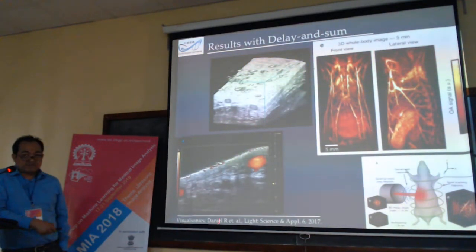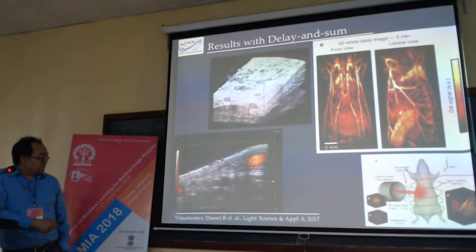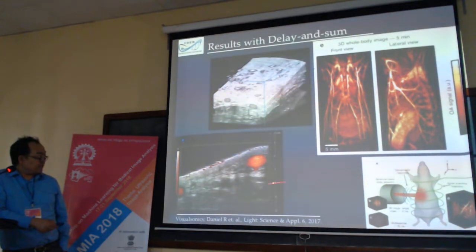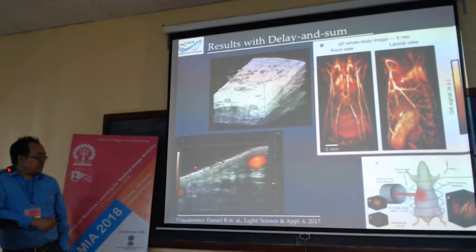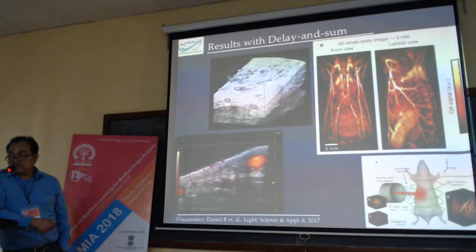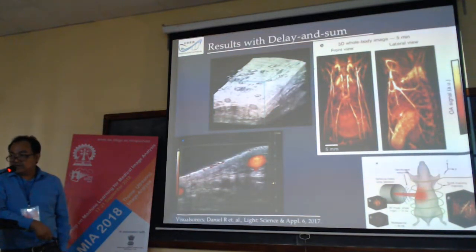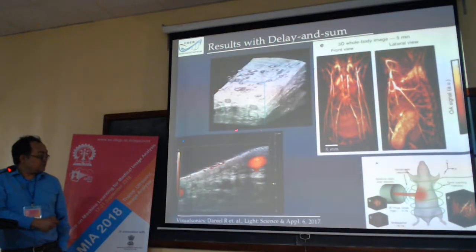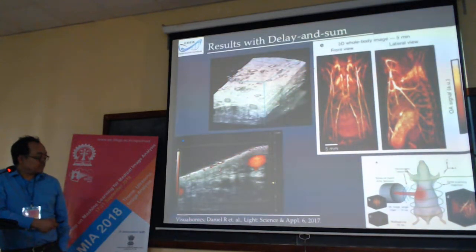This is the dual imaging modality, ultrasound and photoacoustic. If it is only photoacoustic, we cannot get this one. We don't get the structure of the tissue, we get only the absorption contrast. But when we are giving it to the doctors, what about giving it together with the structural information of the tissues? That is what it's doing. So, in this VisualSonics imaging system, they can provide the structural information as well.